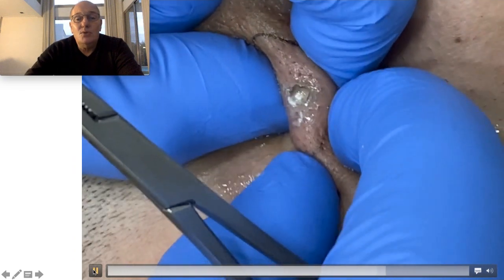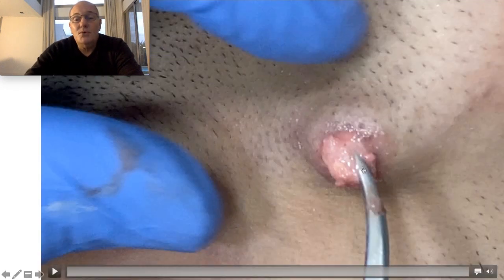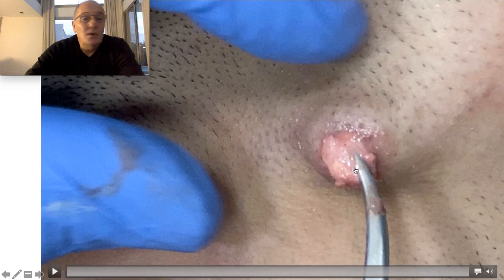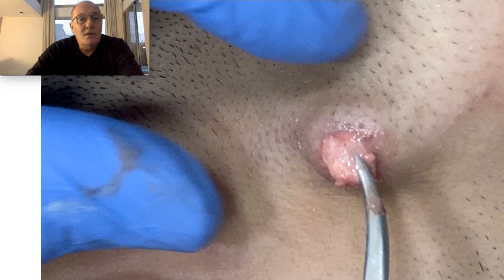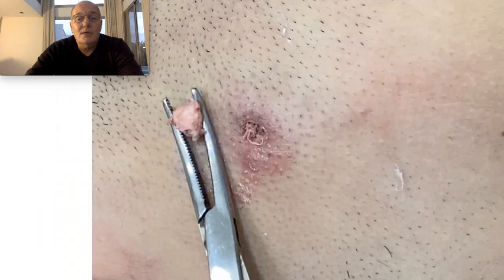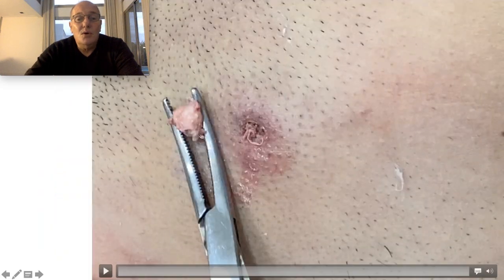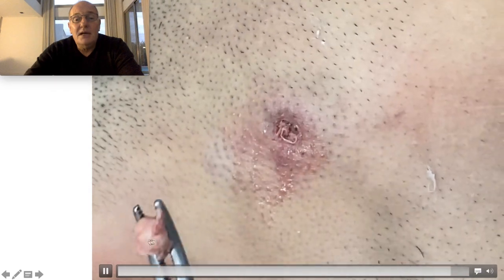Here is how I begin to drain the contents of the cyst, and here is how I use this tool to go into the hole and take out the cyst. This is a very small hole in the skin, and from this very small hole I can remove all of the cyst.